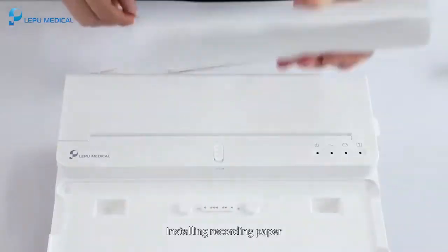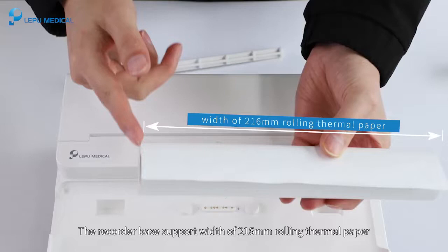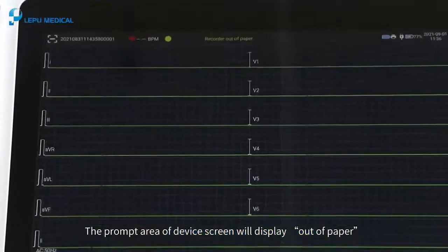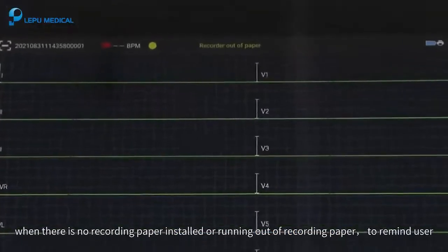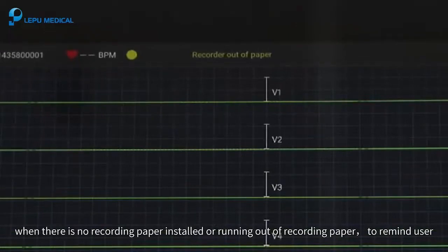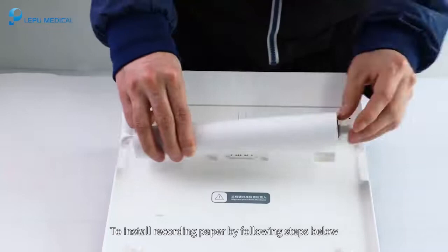Installing recording paper. The recorder base supports 216 mm wide rolling thermal paper. The prompt area of the device screen will display out of paper when there is no recording paper installed or when it runs out of recording paper, to remind the user. To install recording paper, follow the steps below.